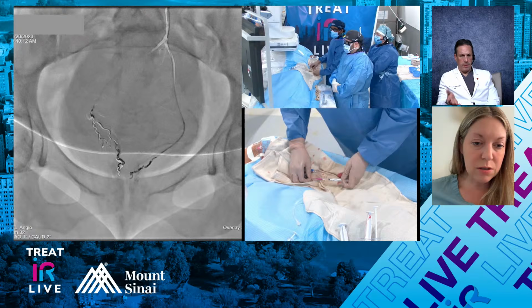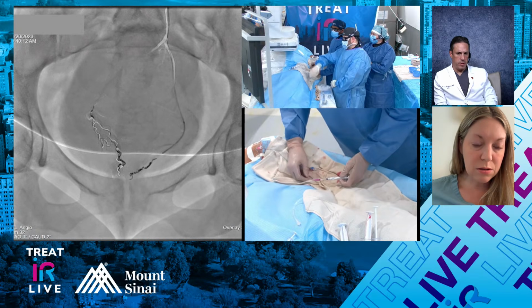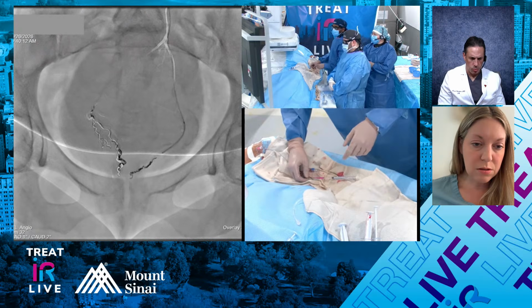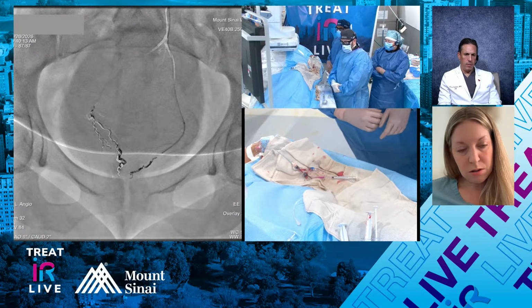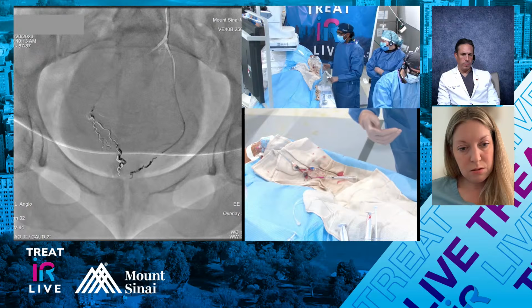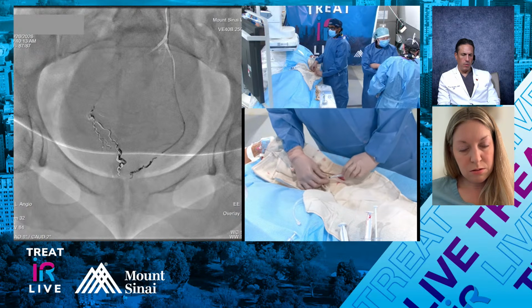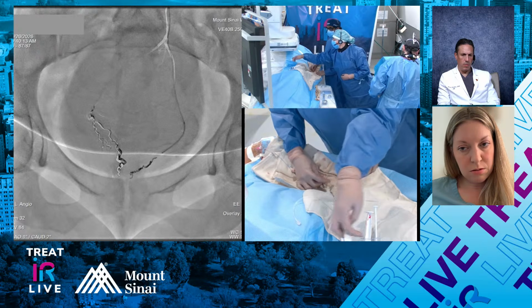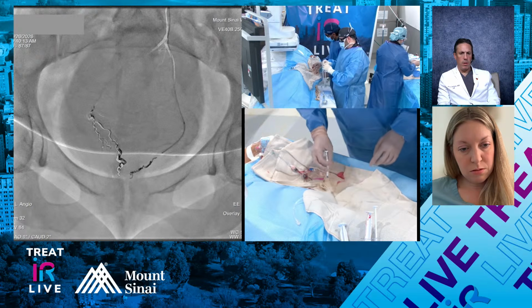My general feeling on this, at least based on this angio, looks like you guys were going to do that's all just one coil, right? Yeah, that was one coil. I'm gonna place another one here because there's a branch coming off. Place another 2/8 here and see if it packs against it. The interesting thing is, is it coming off there, or is it that more superior medial branch that's feeding it? You'll see. I'll do a better run right here.